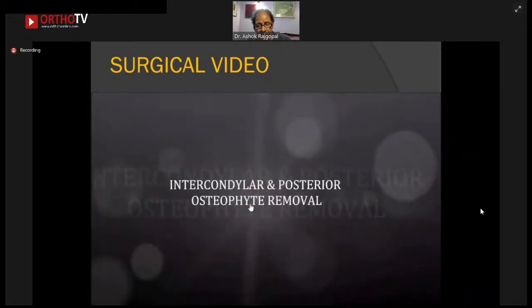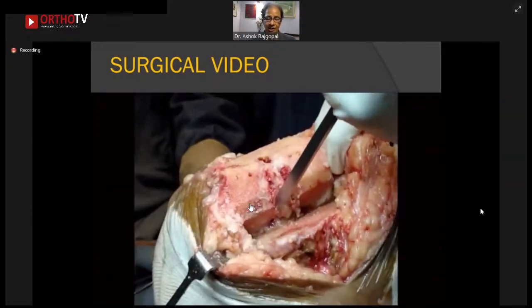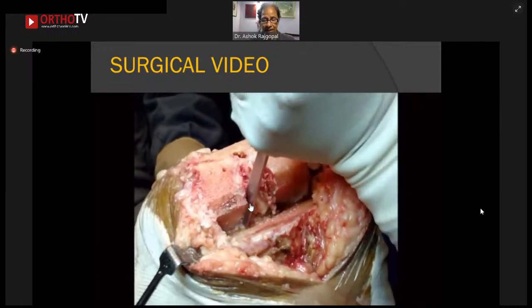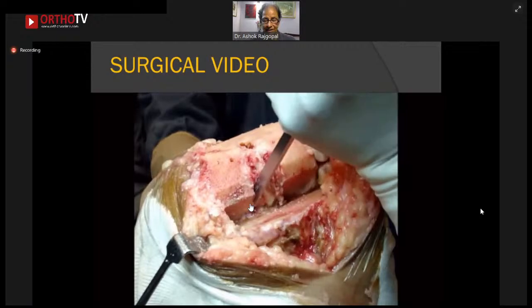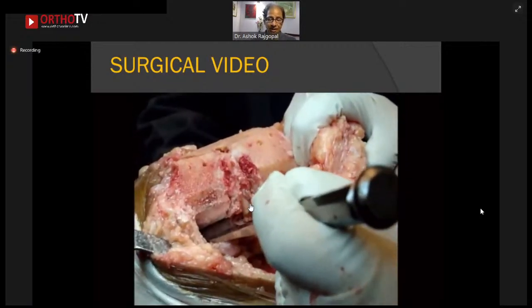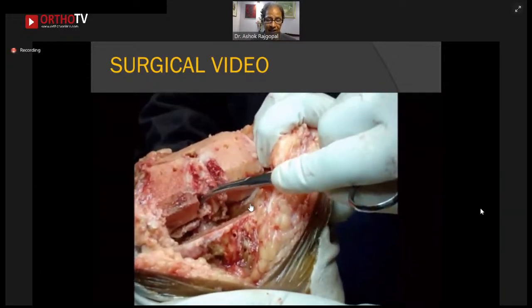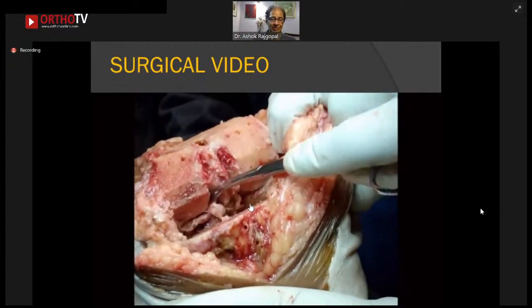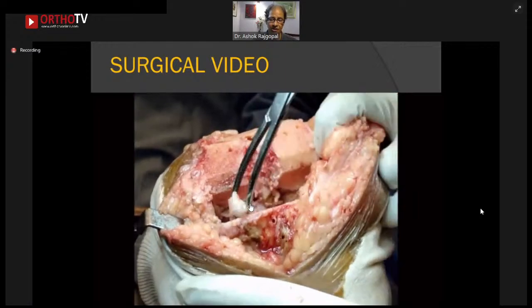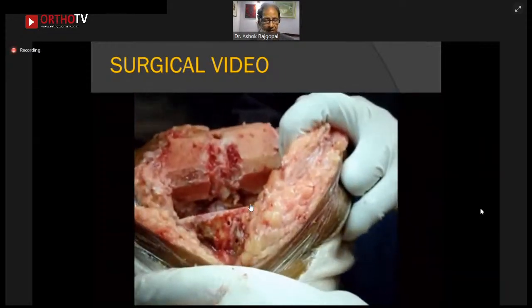And once you've done that, we take down again the balance of the, you can see over here that there is this posterior intercondylar osteophyte. This is a cruciate retaining design. So we are very, very methodical about taking that part out. And this is a posterior condylar osteophyte. So we basically decompress the intercondylar notch. So you free up the PCL.